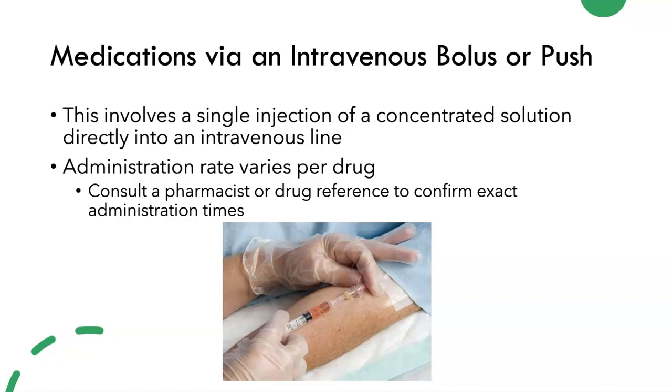So whenever you are giving an IV medication, we are going to either give it directly into the needleless port if they're not hooked up to IV fluids. If they are hooked up to IV fluids, you're going to find the port that's closest to the site of the IV to give the medication through. You don't want to give it through a port that's way high up, and then it takes forever to get that medication to the patient. So that's why we choose the closest port.